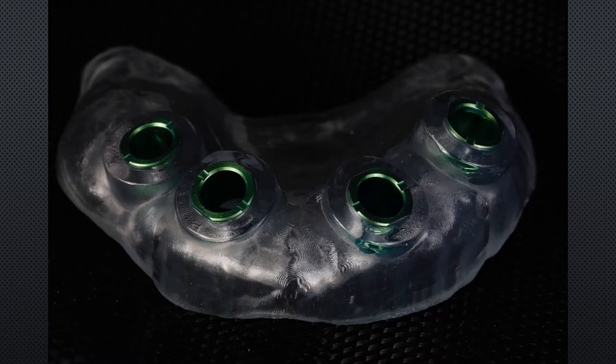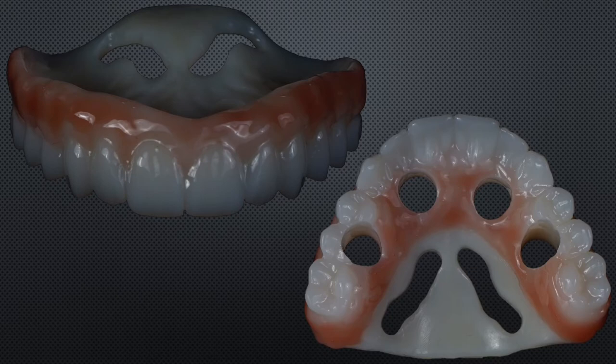But the really nice thing is something like this, right? We took that initial design, brought it back in, those access channels, I punched them out in 3Shape, zipped out this little thing on the palate. So when he seats it, it sits on the palate fully. He picks up all the temporary cylinders, takes it out, and you can just open it up, and she has a very nice open palate for better comfort.